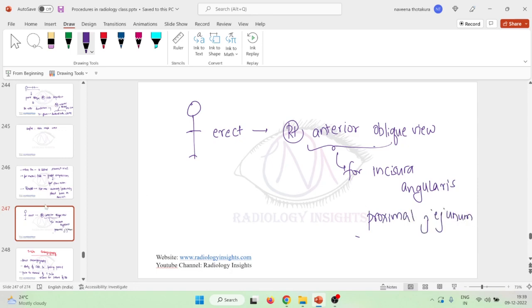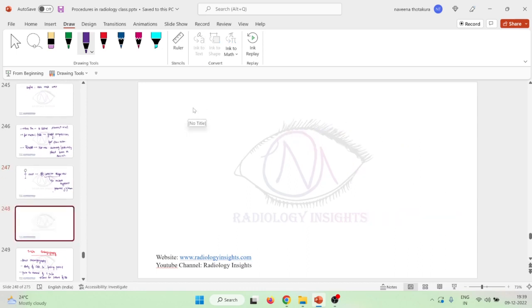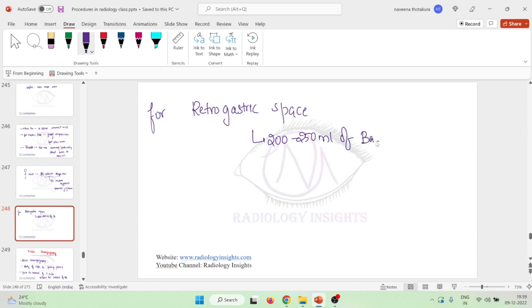Okay. Then we also have the retrogastric space. What is this retrogastric space? That is the space behind the stomach. So for retrogastric space visualization, we should give 200 to 250 ml of barium.